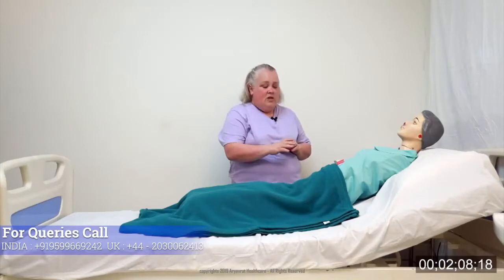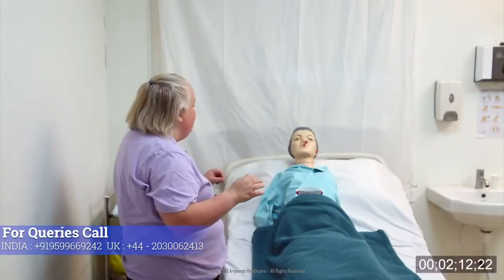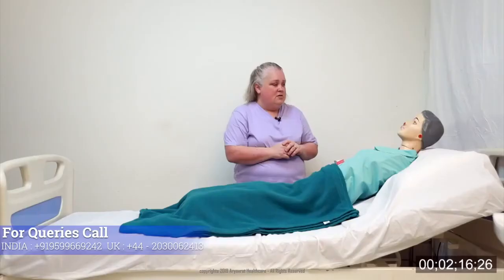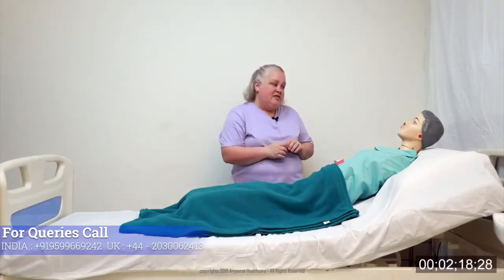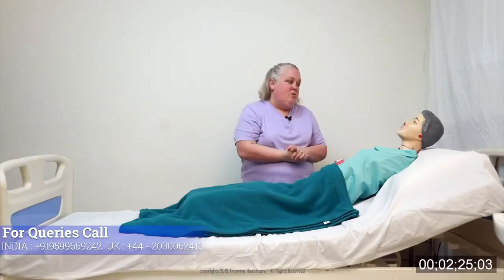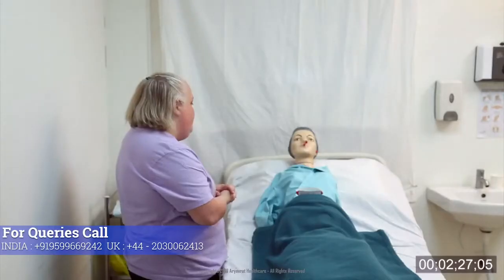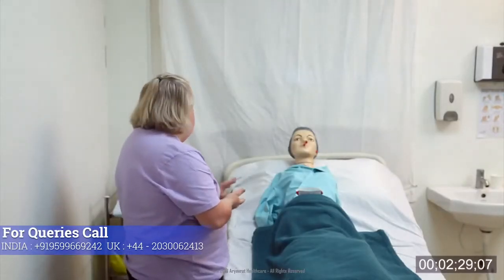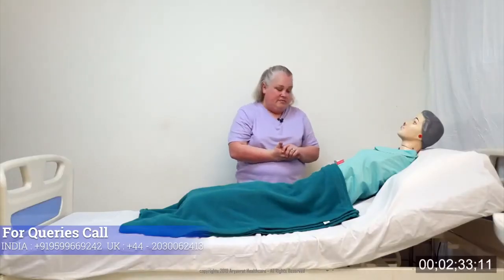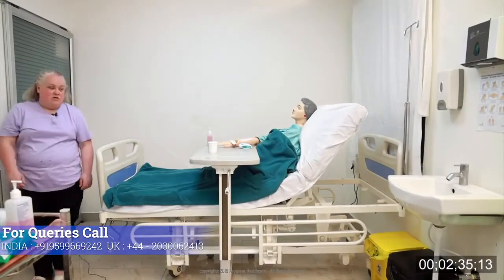Now, although I won't need to expose you too much, would you like to have a chaperone present whilst I do this? No, I'm fine. Okay, and would now be a convenient time to do that? Yes, please. Okay, so I'm just going to pull the curtains to give you some privacy and go and wash my hands and get my equipment. Is that okay? Okay, so I'll leave you with the call bell should you need anything, and I'll be straight back.